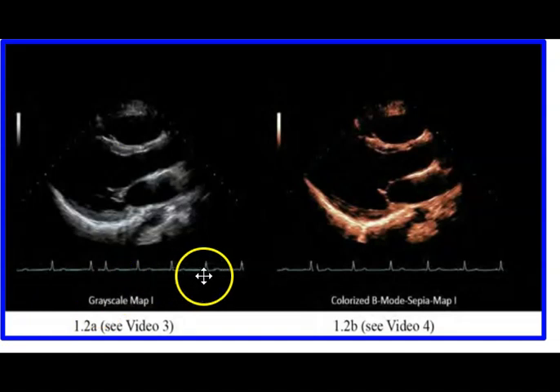And here you can see we have grayscale map 1 over here, and we've turned on colorization. This is sepia. I use this color a lot. I just like it, my eye likes it or something. Some people don't like it, but that's all it is, just pushing a colorization button on the machine on our front panel. Some of us have played with that.